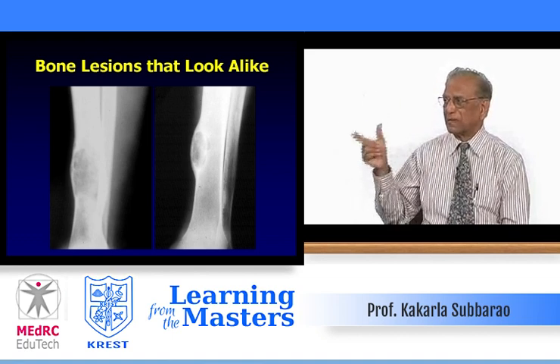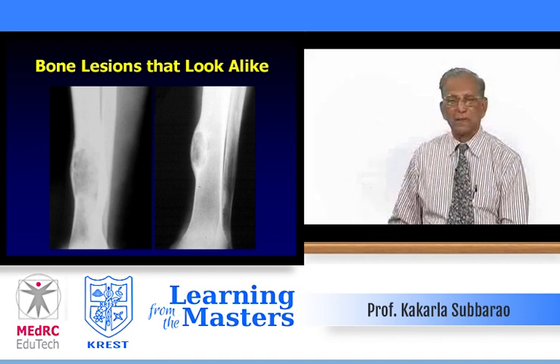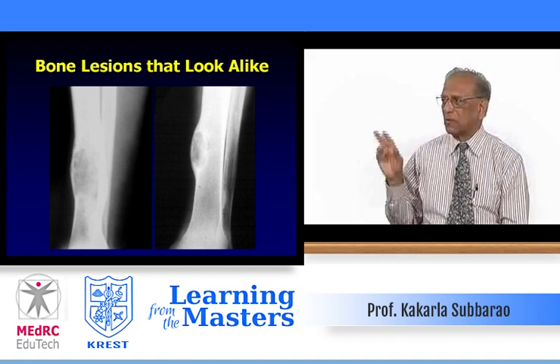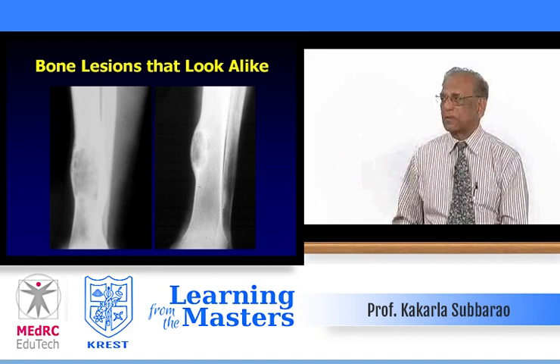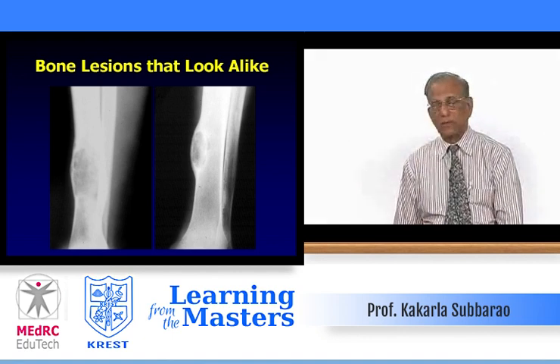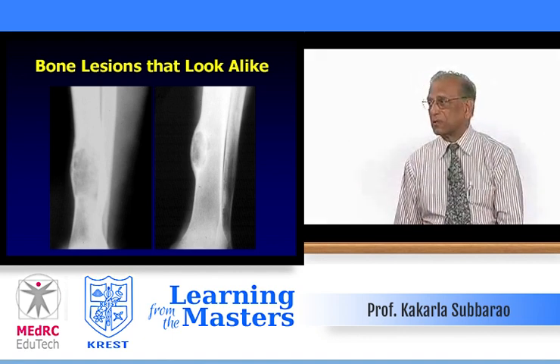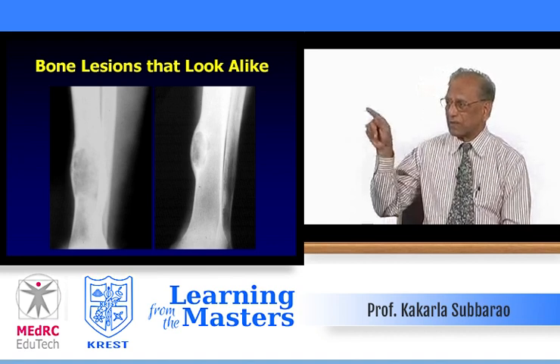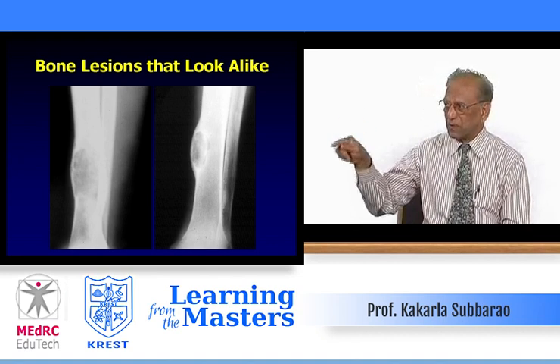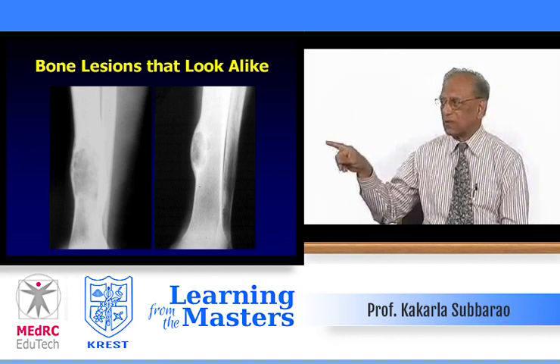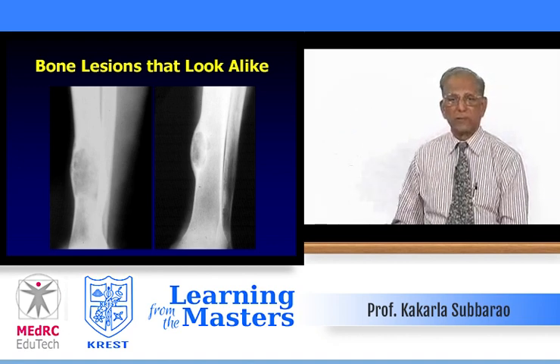On the left side, a tower-shaped periosteal exostosis — post-traumatic, triangular and dense, looking like an exostosis. On the right side, an enchondroma with a hook-like appearance, eccentric in the soft tissue. Although there is no calcification, it is a chondromal lesion — classical chondroma appearance. Tug exostosis is common and post-traumatic.